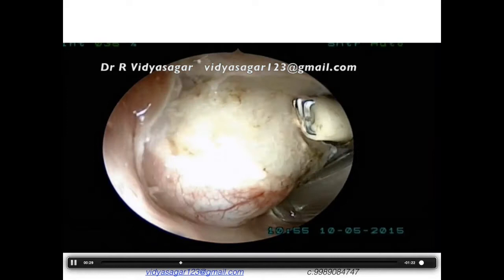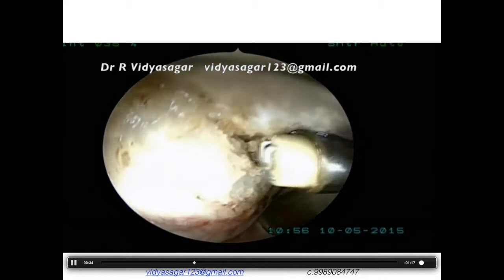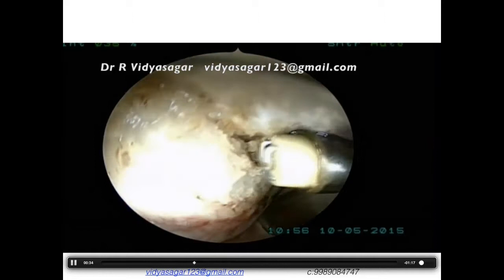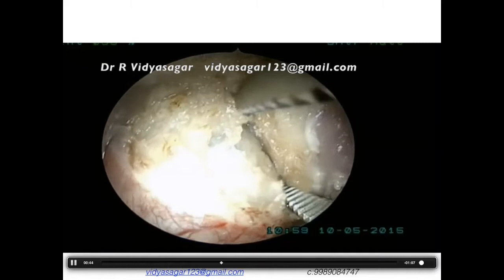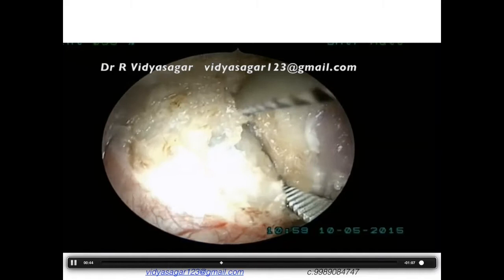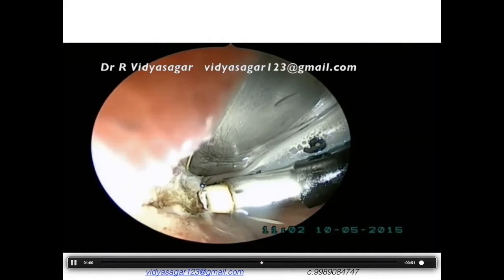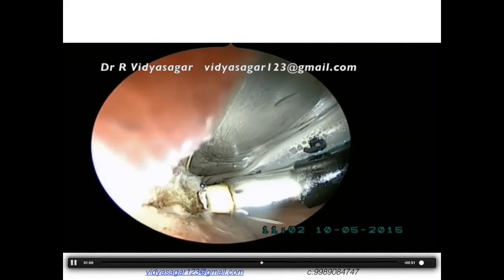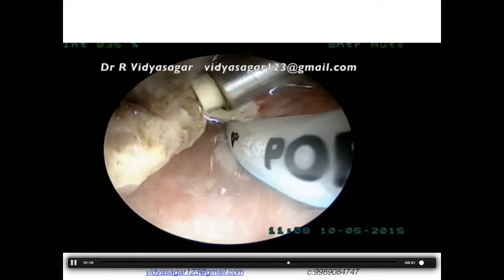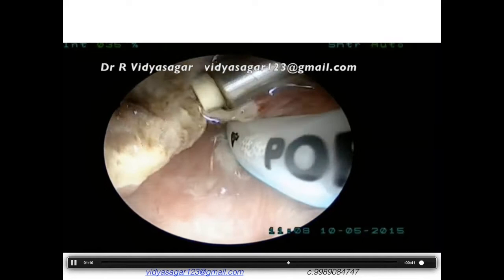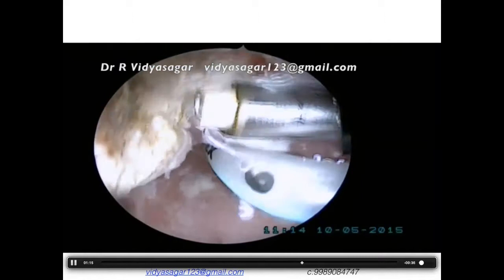Whenever I wanted to get into the plane of the muscle, I used touch mode — contact mode — where more thermal cutting occurs. For ablation you need near-contact mode. In between I stopped and used regular tissue forceps to dissect, then once I knew the plane, I resumed the coblation wand. I then identified the attachment to the lateral pharyngeal wall, reoriented with the endoscope, and identified the pedicle to resect the entire specimen.